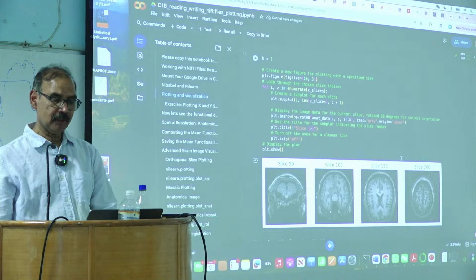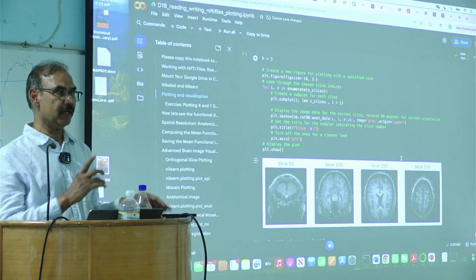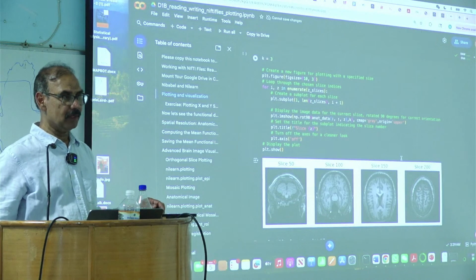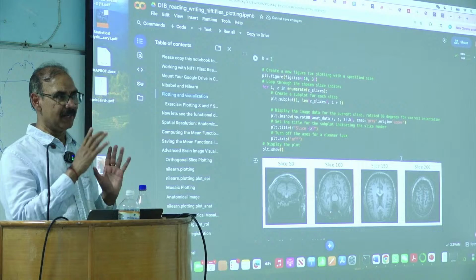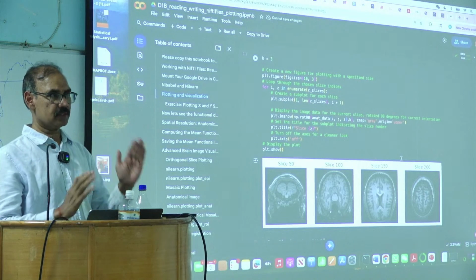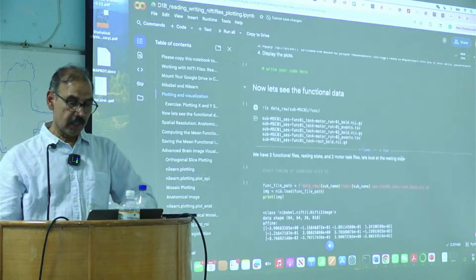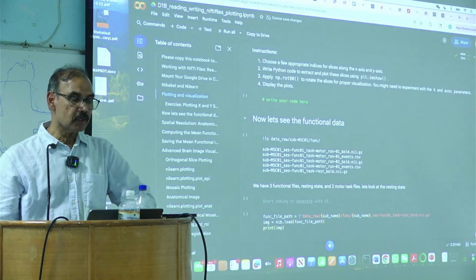I think the trouble with rotating at an angle other than multiples of 90 is that the matrix dimension changes, right? So you have to correct for that. Okay. So now, let me see.